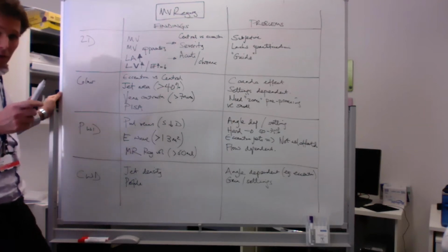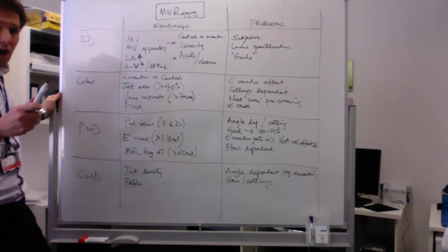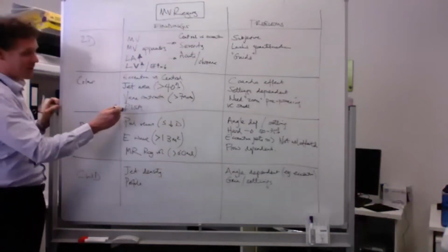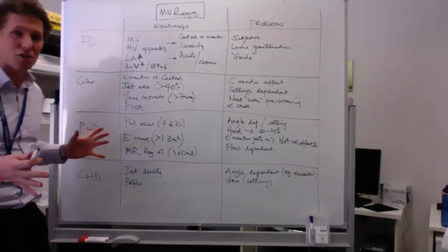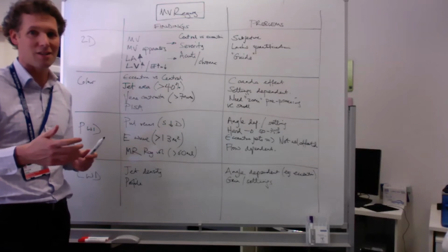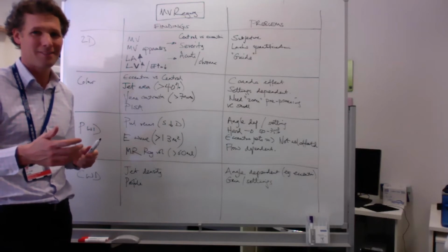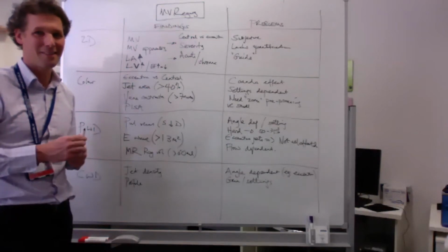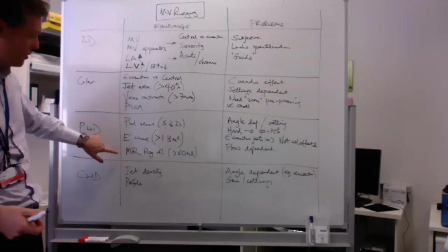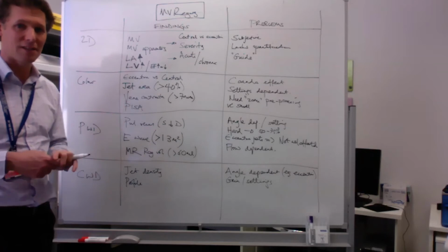Ray, you're a cardiac anaesthetist, is that right? Yeah, I am. So you're probably going to be asked about this a lot. I'm sure you get surgeons who, after they've finished doing their surgery, want to know what the regurg volume is, assessing severity. Do you get that a lot? So after a repair, you mean? Yeah. And how do you do it? Do you use PISA? How do you assess it?